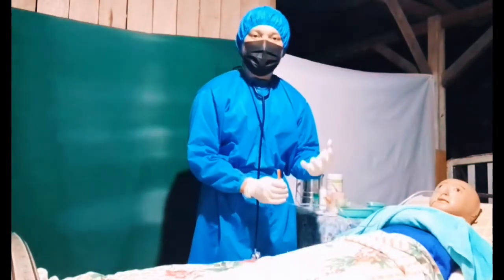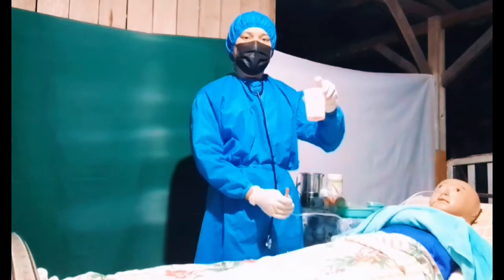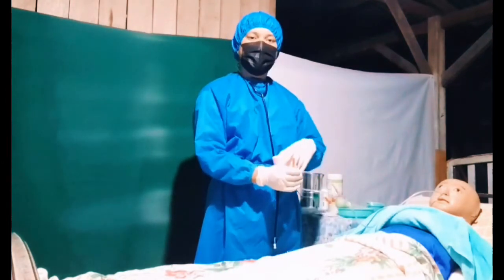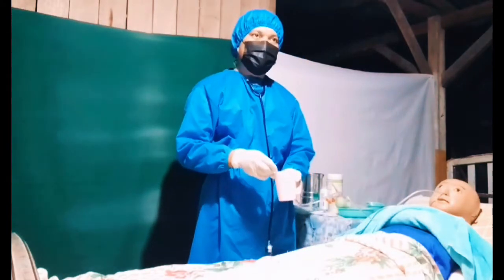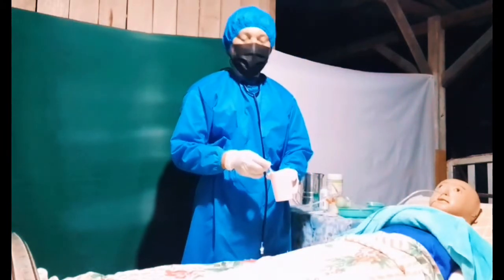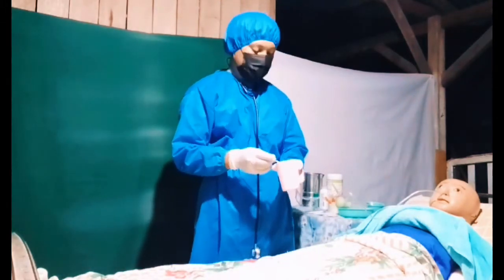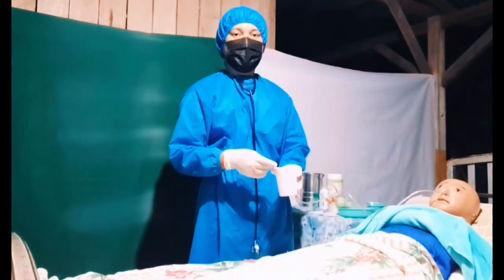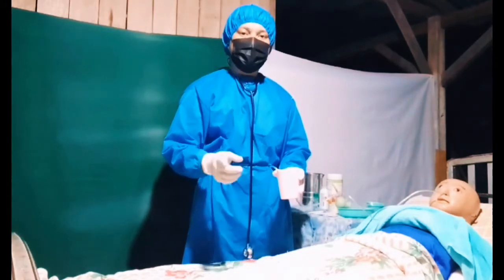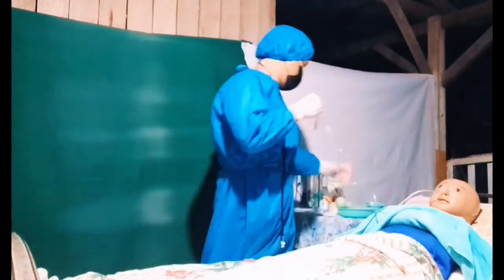Another procedure in checking the placement of the tube is to get a glass of water and submerge the tip of the tube and see if there's a bubble. If there is no bubble, that is good, but if there is a bubble, that indicates that the tube is in the lung, and notify the doctors quickly. So there is no bubble.